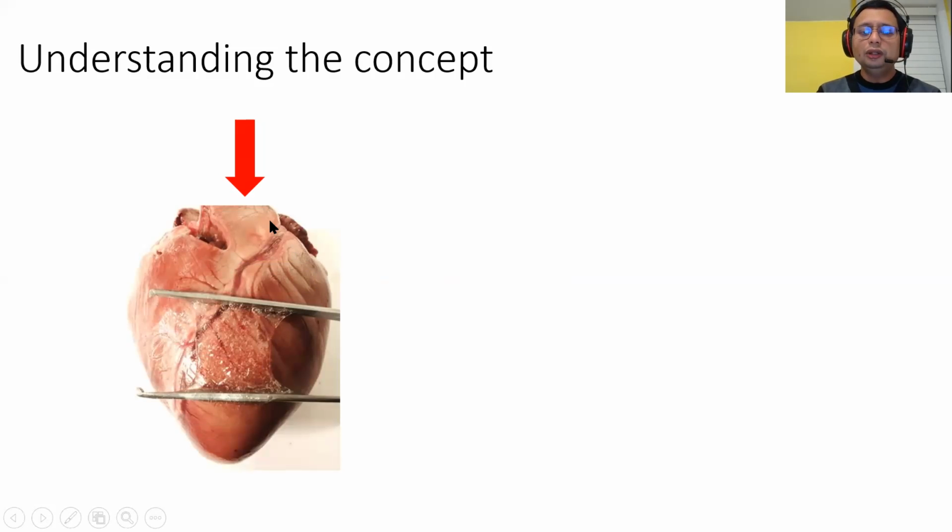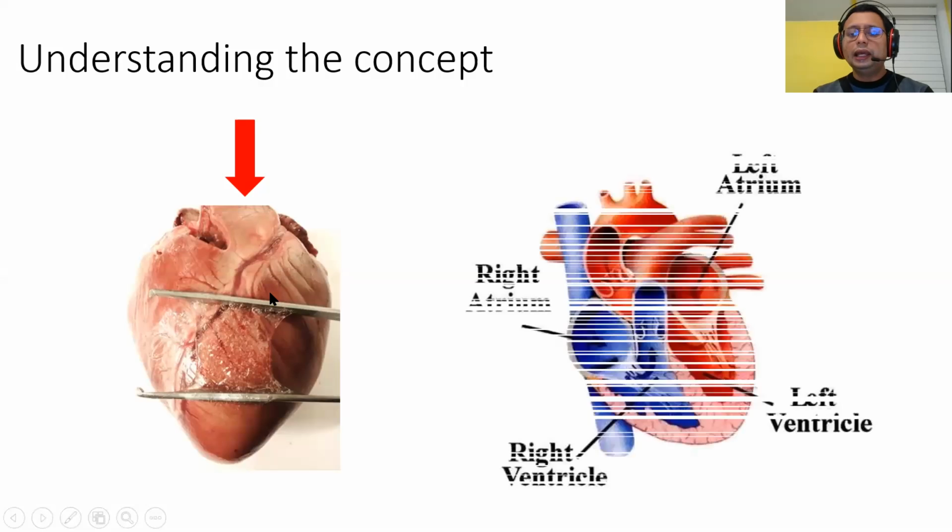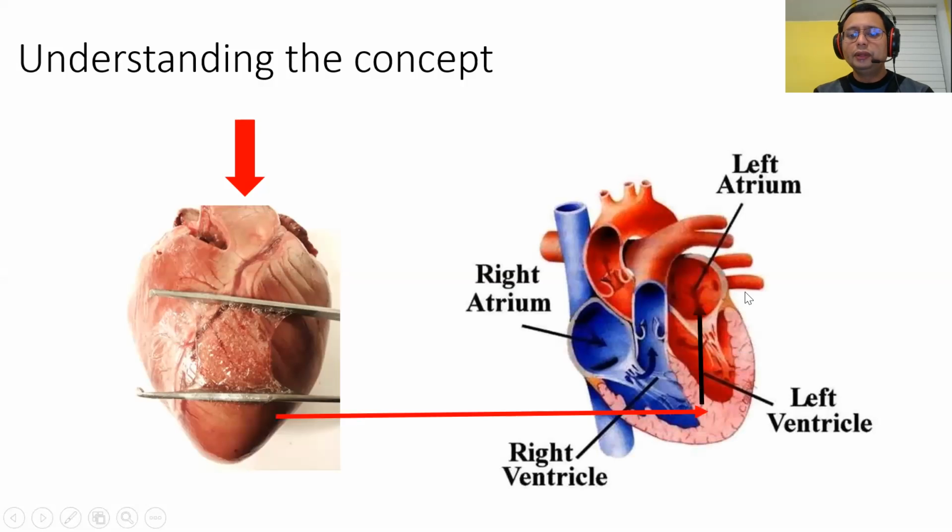Once you determine that your left ventricle is diseased, so you do have diastolic dysfunction, you have impaired relaxation, the question is, how bad is this left ventricular myocardial disease, and does it affect the left atrial pressure? So does the left atrial pressure increase or not, which can cause dyspnea?